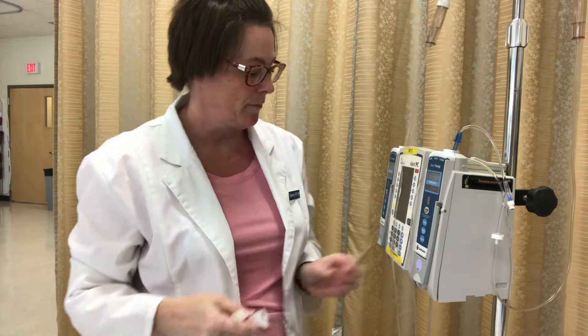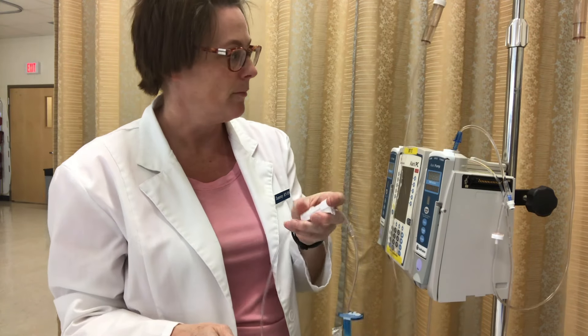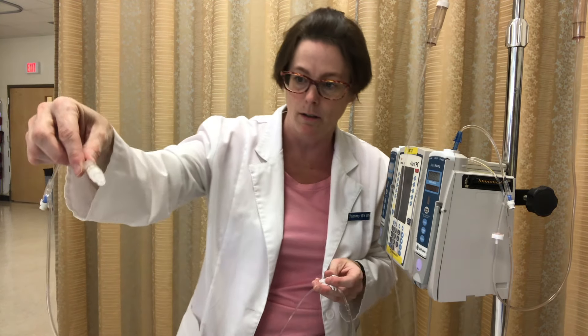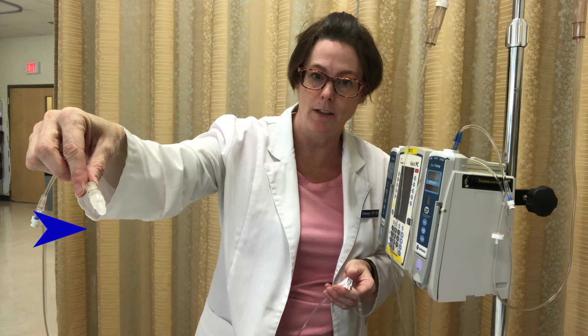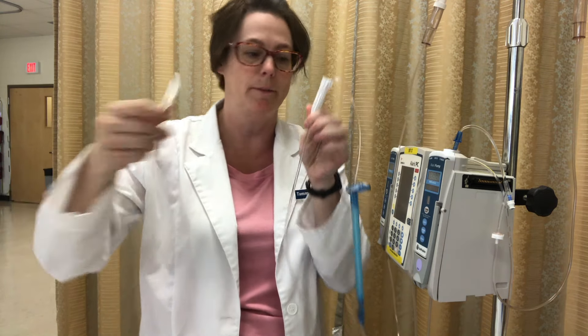I've got my fluid in the drip chamber and I'm ready to let it roll. I'm going to open up my roller clamp — the fluid is now flowing. You can see those drips. It's now fully primed. I'm going to lock it off. At this point you would use your sterile swab to clean off the smart site, attach a syringe, and remove any air bubbles.